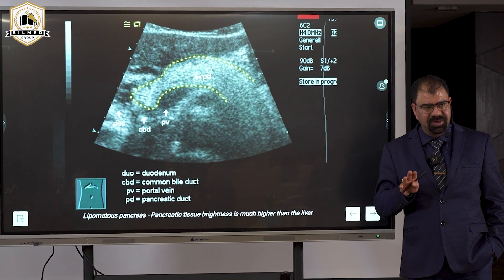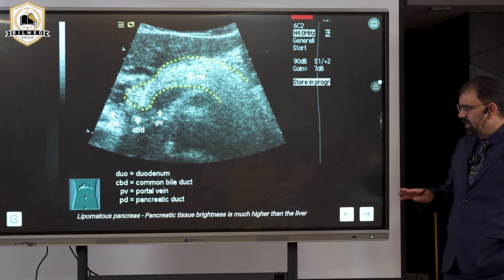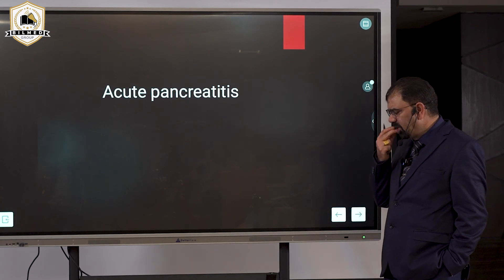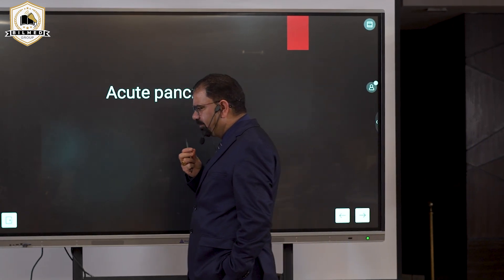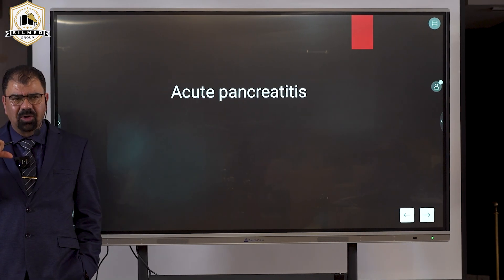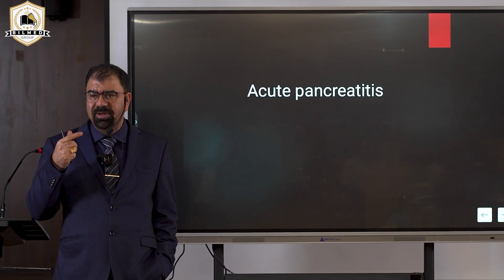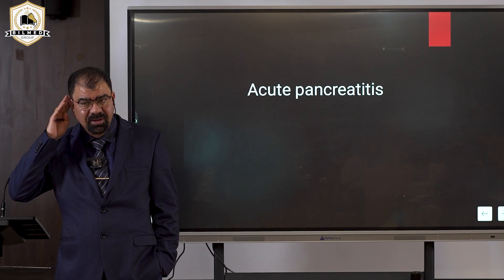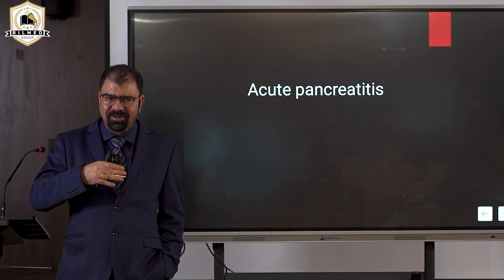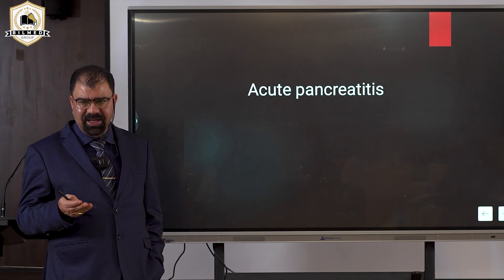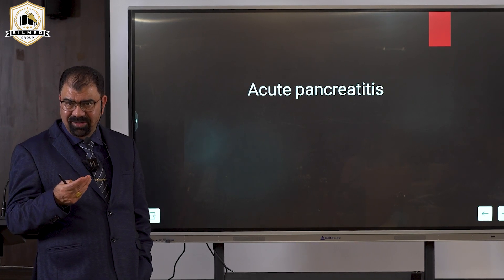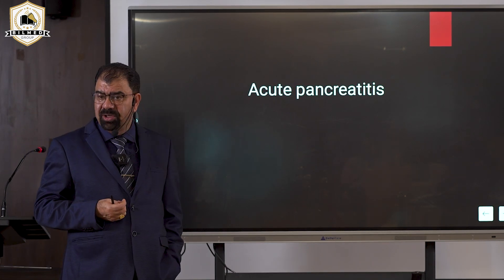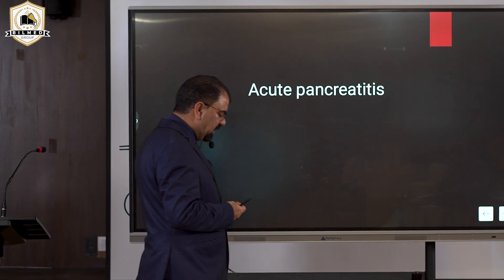In acute pancreatitis, the echogenicity will decrease. The pancreas will appear similar in echogenicity to the liver. The scale here is the liver — if your pancreas is not more echogenic than the liver, that indicates hypoechogenicity, meaning inflammation is already present.